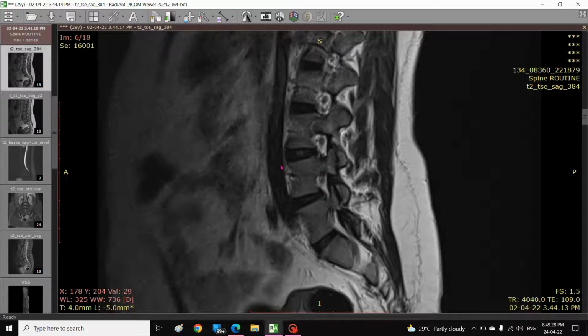Interestingly, you could also see the aorta here. You see the relationship of the descending abdominal aorta with the anterior vertebral margin over here. And remember, aortic aneurysm is one of the reasons for the back pain, which is a kind of red flag and medical emergency. So this patient doesn't definitely have that, so we will ignore that as of now.